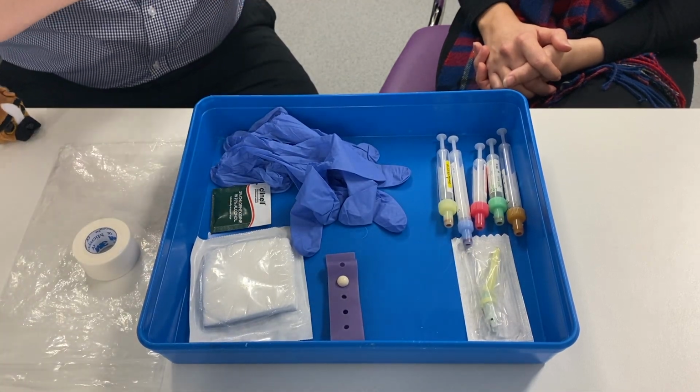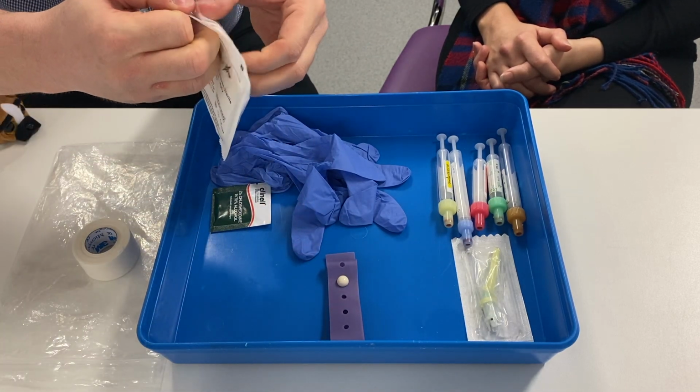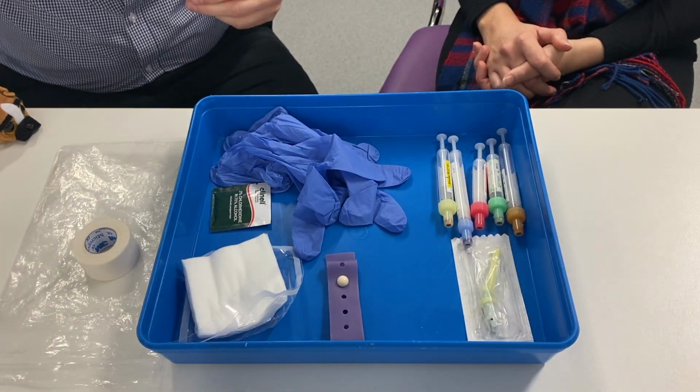Before I go to the patient, I'd want to, with my hands nice and clean, prepare as much as I can. So I might open up my gauze packet just so that my gauze is accessible to me, and I'd leave that in the tray like that.